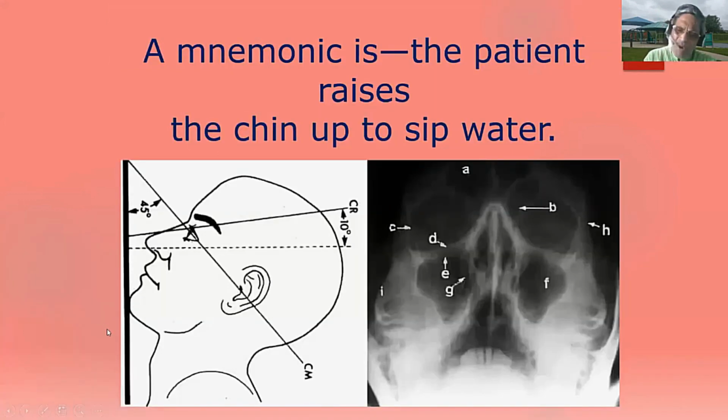The chin. This is what the X-ray plate touching the skin means. As if you're drinking water, man. That's all. Just remember this. It's not because of water, it is a person's name. That's different. Just remember things for exam purpose. You should know this.